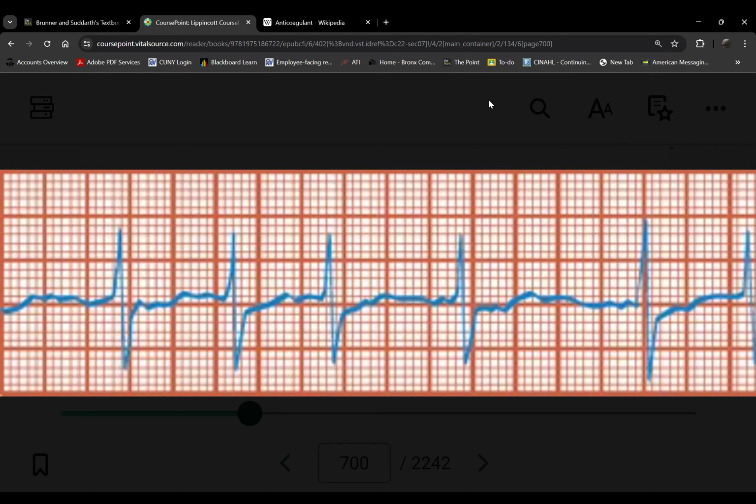However, if your AV node falls for this, meaning the AV node mistook these F waves as P waves, we have a problem. Because look at each one. If there is a ventricular response here, there's a QRS after each one of these. Imagine this patient's heart rate.